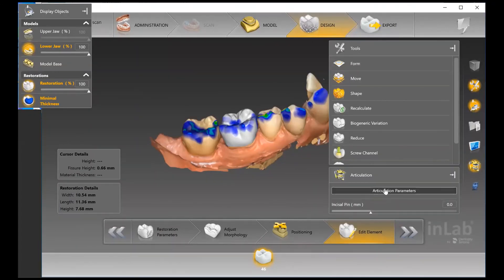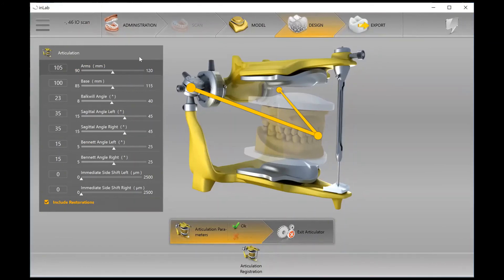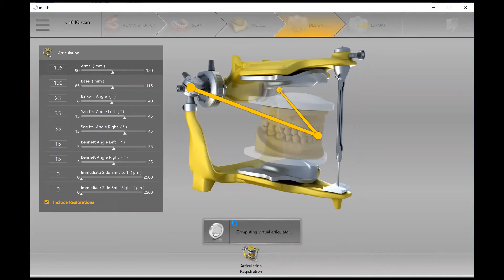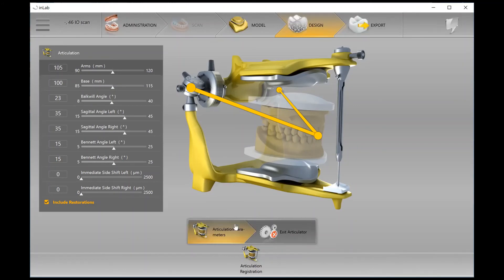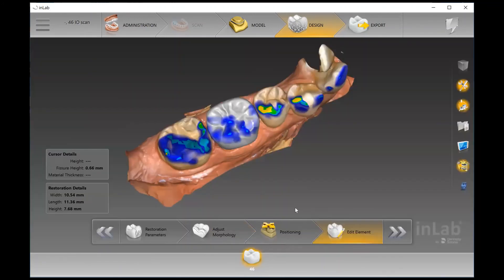Now I'm activating the articulation. I'll click on Articulation Parameters, which opens this screen with a generic universal articulator. If you want to use your own parameters based on your laboratory or clinic preference, not a problem. Hit OK and the software will virtually articulate the case using the actual restoration, letting us see all the dynamic movement for this patient. Once you exit the articulator, you return to the original screen, and you can change any parameters to fit your own specifications.